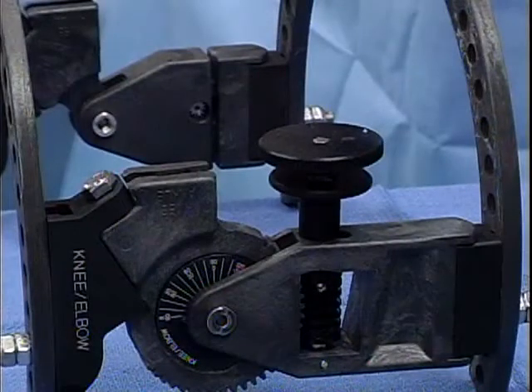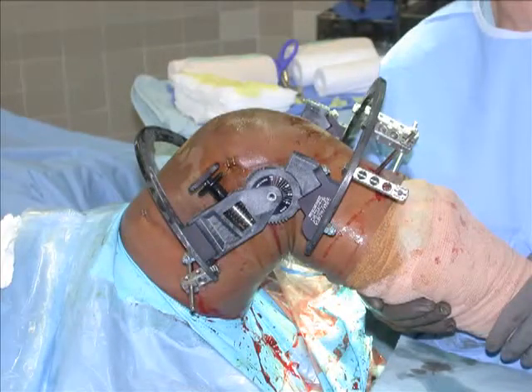A key component is the worm gear and knob, which allows the surgeon to choose between a free range of motion around the center of rotation and locking the knee in any position, using the worm gear to force either flexion or extension. The compass hinge allows aggressive rehabilitation in the sagittal plane, severely limits varus-valgus and coronal plane motion, as well as axial rotation, enabling immediate range of motion with less risk of loss of fixation.